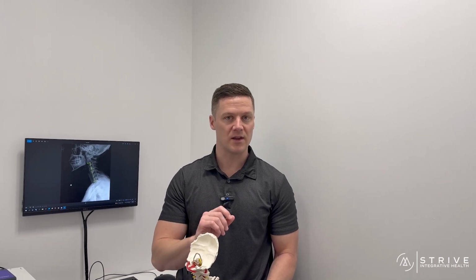What we need to do for these patients is take a specific x-ray so we can see what joints are working and which ones aren't working. So what we have our patients do during the x-rays is not only having them look straight forward, but we do something called motion studies, where we have our patients bend their head forward and bend their head back so we can see exactly where it's putting pressure on those nerves.